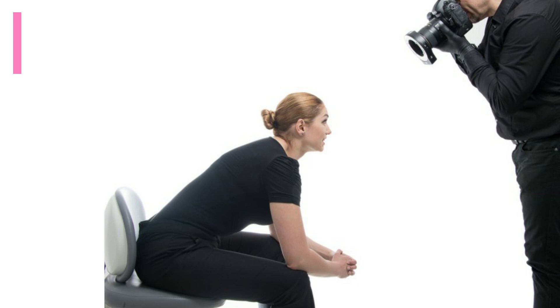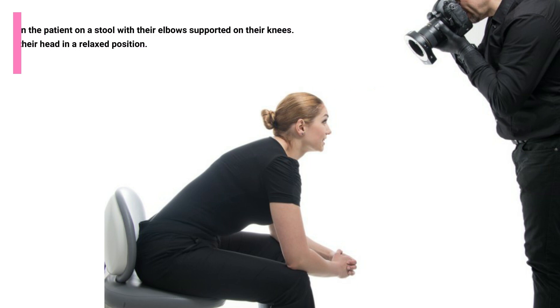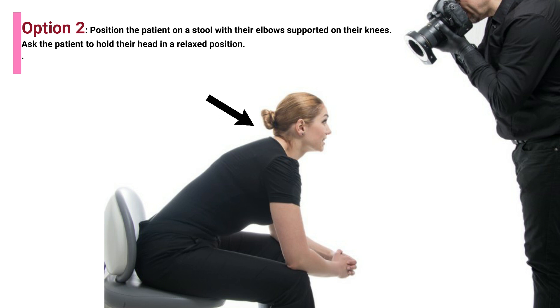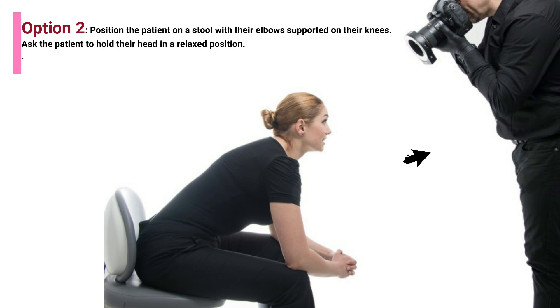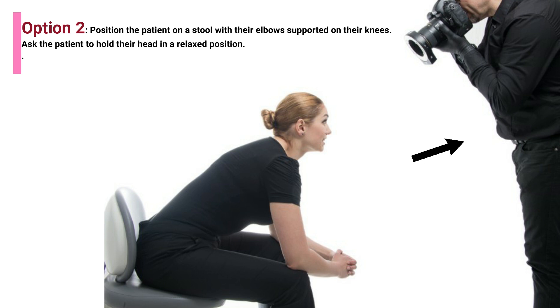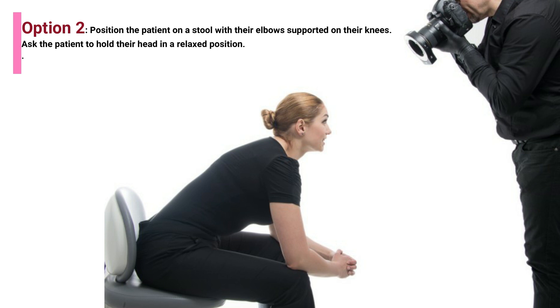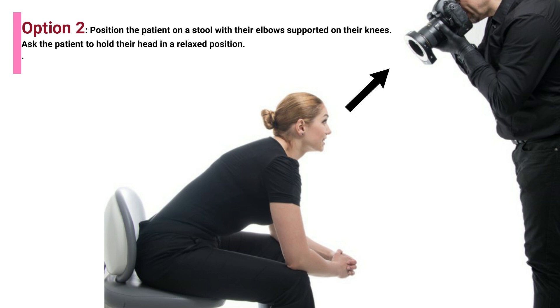Option 2 for the 12 o'clock: put the patient on a stool with their elbows supported on their knees and ask the patient to hold their head in a relaxed position. Take your position in front of the patient, and have the patient make a full smile and raise their eyes in the direction of the camera lens without changing the position of the head.